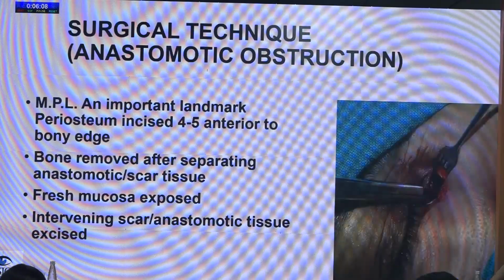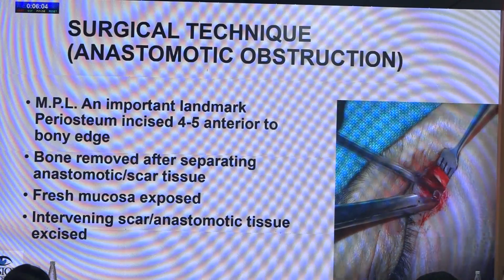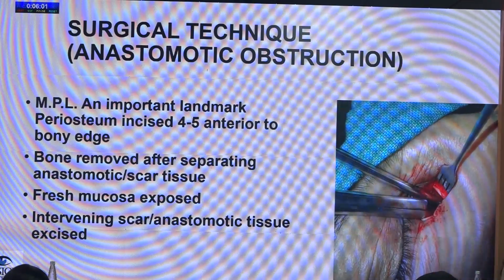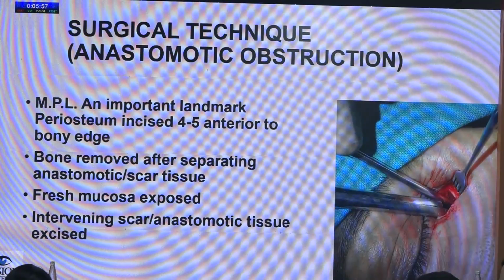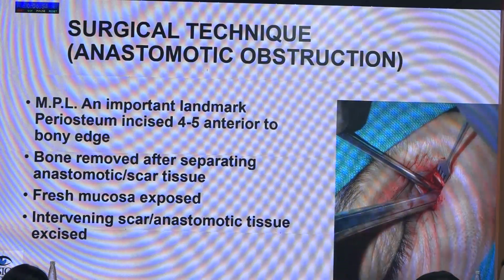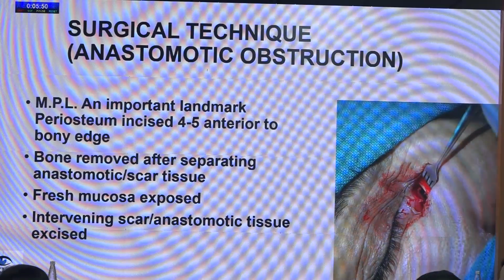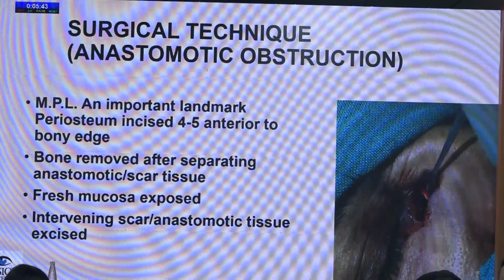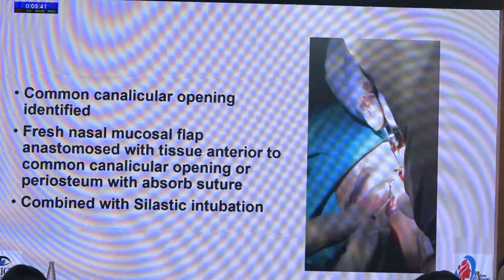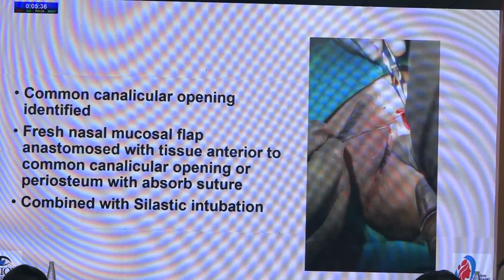Now, with respect to the surgical technique, the landmark that I'm talking about is the MPL. Make your assistant hold the cat's paw just where the MPL starts, or just parallel to the MPL, and make sure they don't keep going downwards. That makes sure that you're in the right spot, so then you won't have too high an opening or too low an opening.